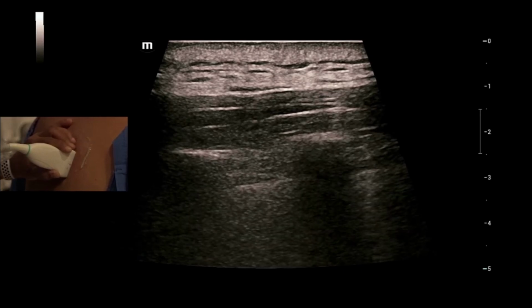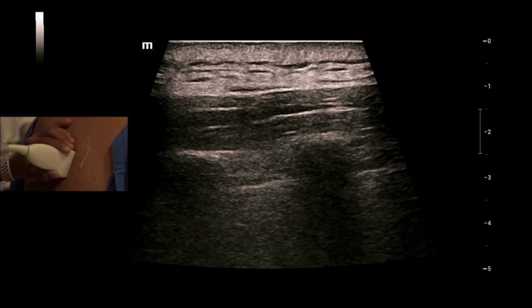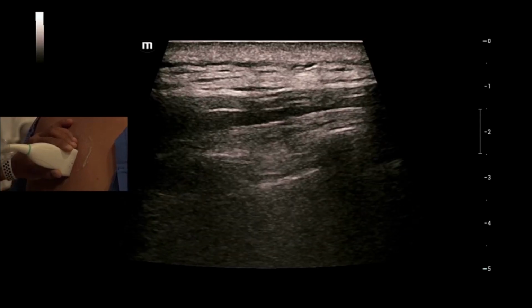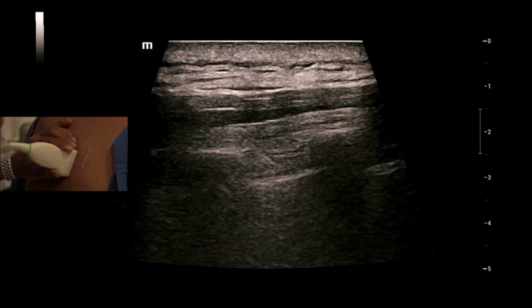So a scan that will give you consistently, repeatably, I can't stop saying those words, right? And reliably produce images that give you anatomy as well as the needling consistently, clearly, that is desirable, okay? And that's not with the linear probe. Curve probe. Can we switch, please? Now, often they say the curve probes are for deep scanning. Low frequency equals low quality images. That used to be in the past.